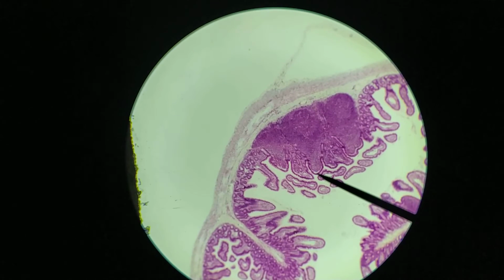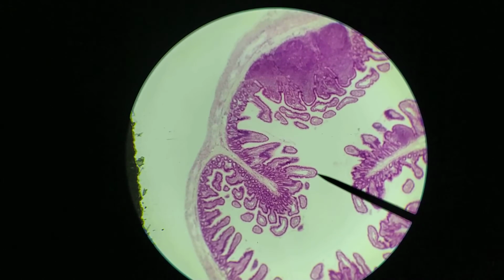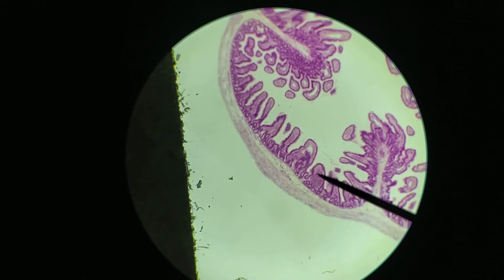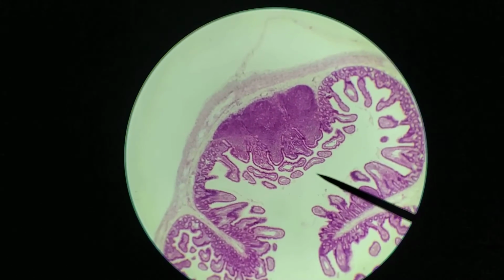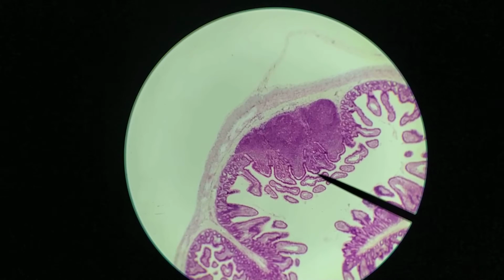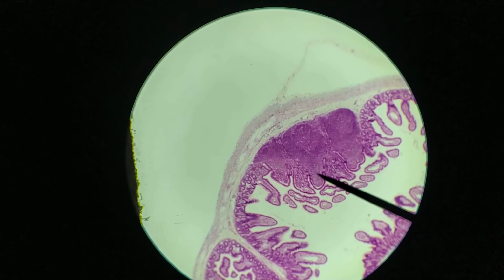And again, because we make these cells much more prone to allowing pathogens to cross, the chances of a pathogen crossing here is much greater compared to anywhere else in any other part of this epithelium. Okay, and so again, you do have the lymphatic system. You have, again, the staining here is quite basophilic in the lamina propria for all of these, but you're going to have this one region here where you have these Peyer's patches where you have an increased ability of these cells to allow pathogens to cross so that they can specifically be targeted to this region. Okay.